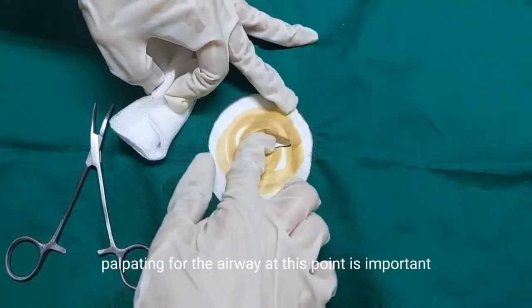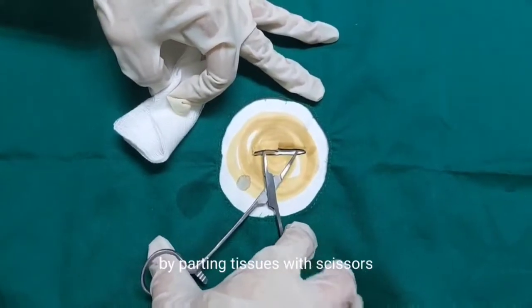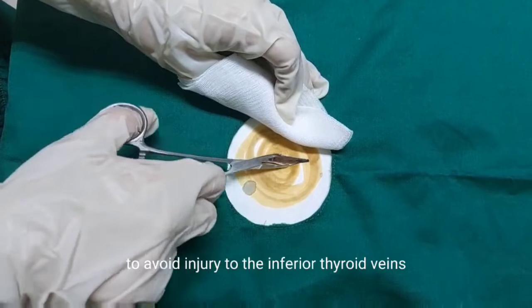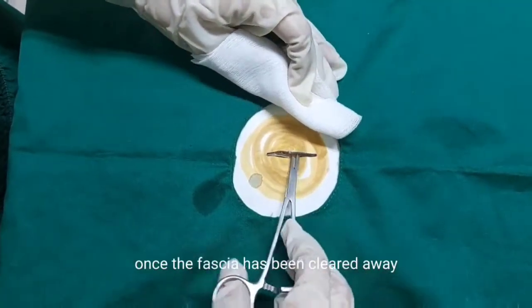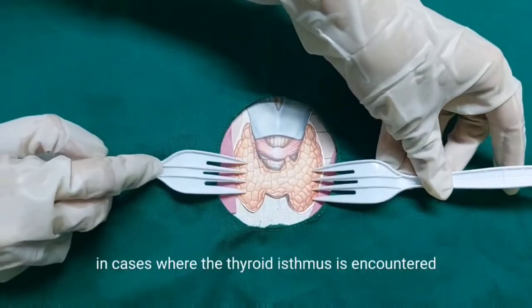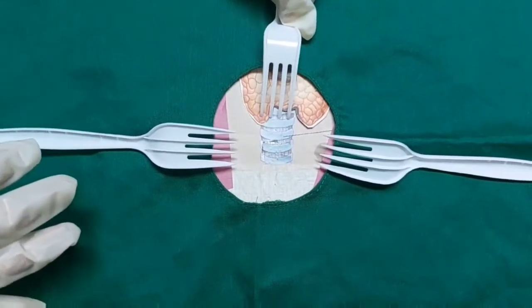Intermittently palpating for the airway at this point is important as it is easier to stray from the midline. Dissect towards the trachea by parting tissues with scissors, remaining strictly in the midline in the vertical plane to avoid injury to the inferior thyroid veins. Once the fascia has been cleared away, identify the strap muscles, divide them at the midline, and retract them laterally. In cases where the thyroid isthmus is encountered, retract it superiorly to have a better view of the trachea.